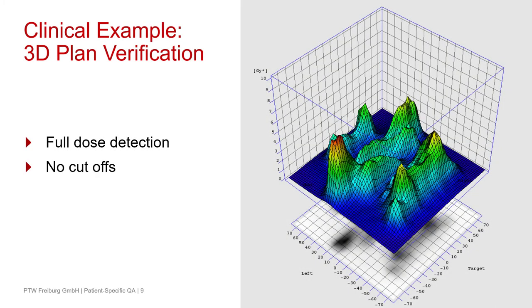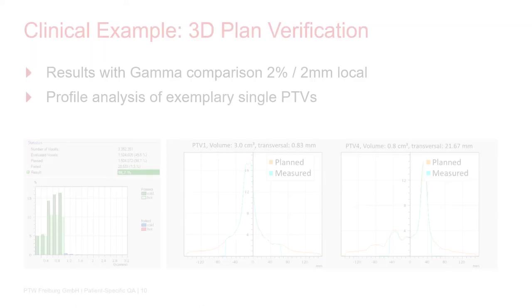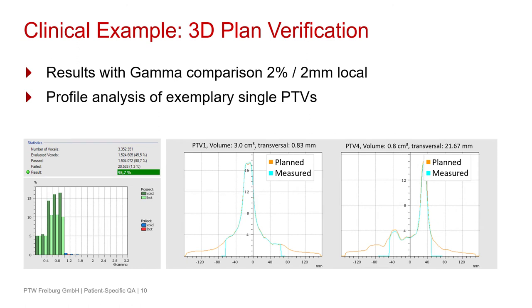Here you can see our 3D dose measurement with our software VeriSoft, and because of the large detector size you have full dose detection with no cut-offs. To analyze this clinical example, we used the local gamma criterion with 2% and 2 mm, and the passing rate was nearly 99%. You can also see a profile analysis of exemplary single PTVs — in the middle the PTV with the large volume, on the right the PTV with the small volume — and you can see that the measured and planned dose fit quite well.